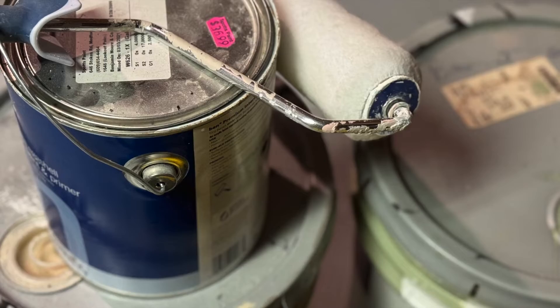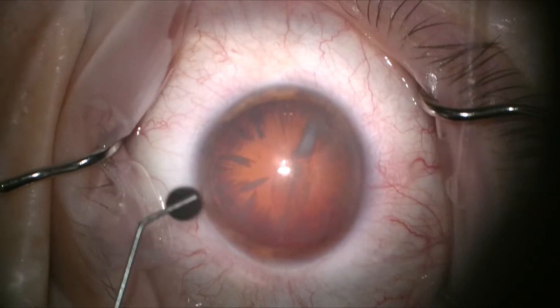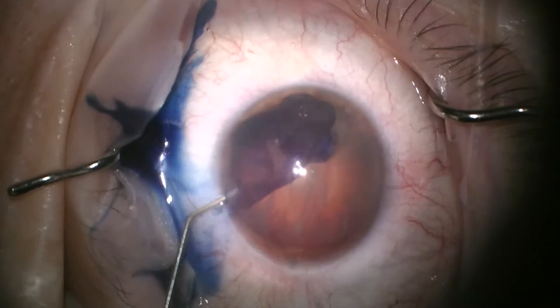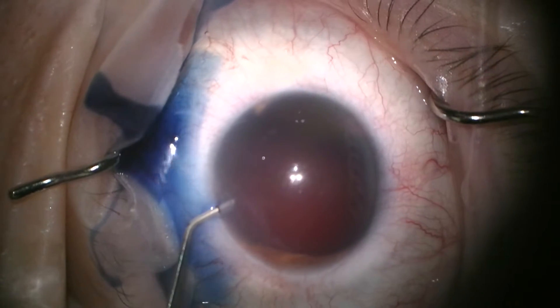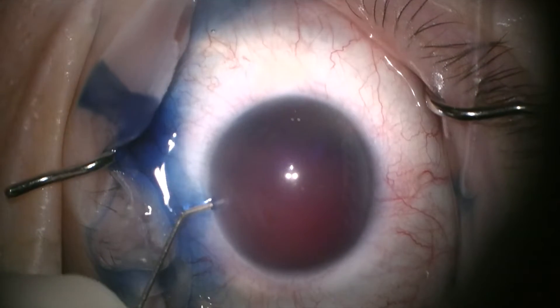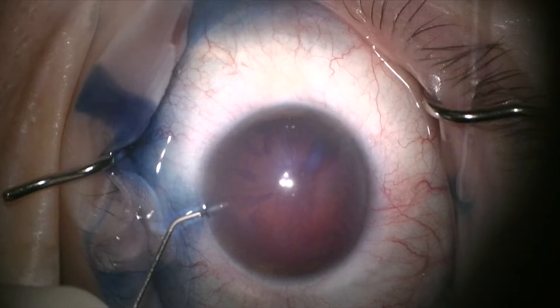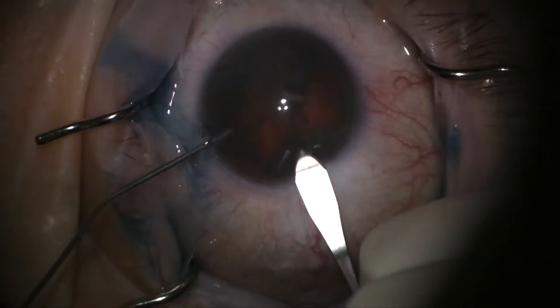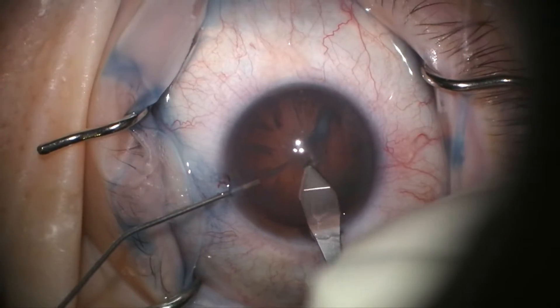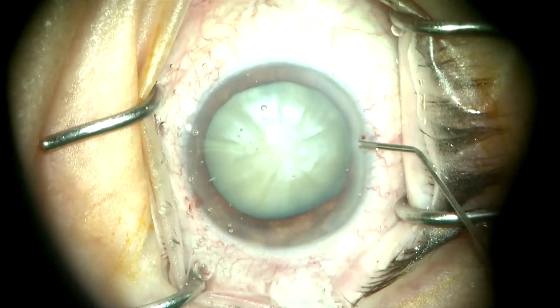So you can place Vision Blue in two different ways — spray it in or roll it in. Here's one example: we're using Tri-Pan Blue for a moderately complex cataract, and this works very nicely. You're putting the Tri-Pan Blue in the anterior chamber, letting it sit for a minute or so, and then rinsing it out with BSS or, in this case, Viscoat. Then you can start your rhexis, and it gives you good contrast. It works well.